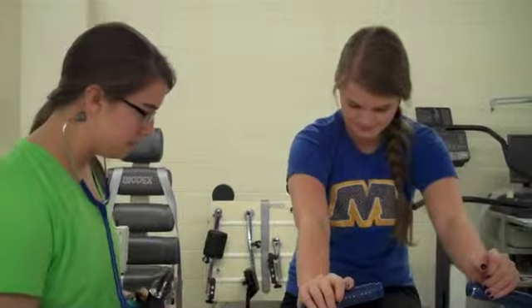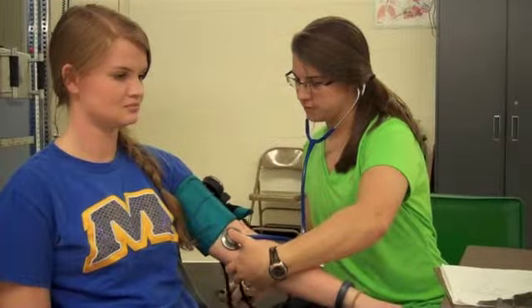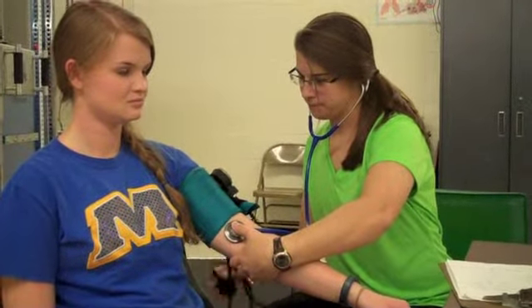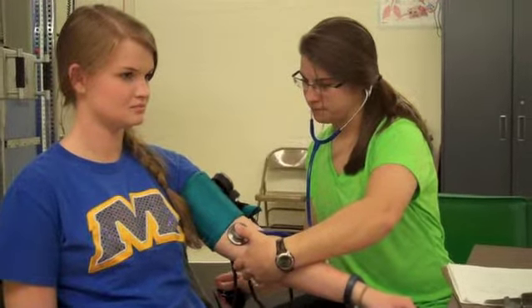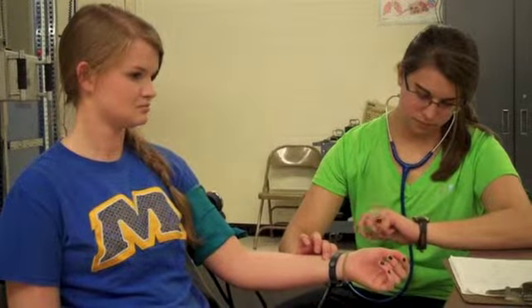You can go ahead and get off the bike now. We're going to have a seat for 5 minutes for her recovery. So Ashley has been seated for 5 minutes with her feet flat on the floor and arms rested at heart level. Now I'm going to take a recovery blood pressure and a heart rate. Ashley's blood pressure right now is at 120/82. Now I'm going to take a resting heart rate. Ashley's heart rate right now is at 76, so she is fully cooled down and recovered.